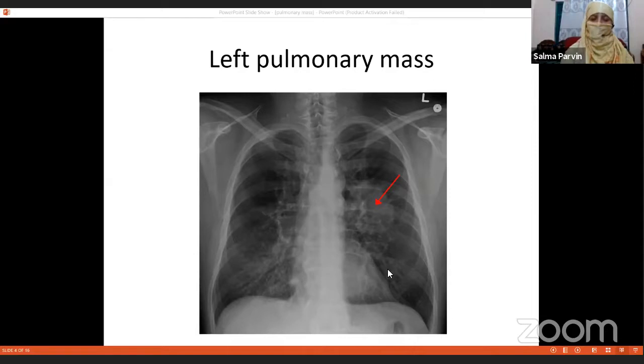But you see, the cardiac mass is shifted to a significant amount to the left. So there is a mild mediastinal shift in here. Then I need to mention that you must not negotiate any sort of mediastinal shift. Whenever there is a mediastinal shift present, you must explain is there any cause, and you have to find out the cause, inside, outside, technical, whatever. Even from the congenital anomaly to the technical aspect, we must explain why there is mediastinal shifting. Regarding this, I spoke about the rotation of the patient and proper positioning of the patient in my previous lectures. I think you can go through those.